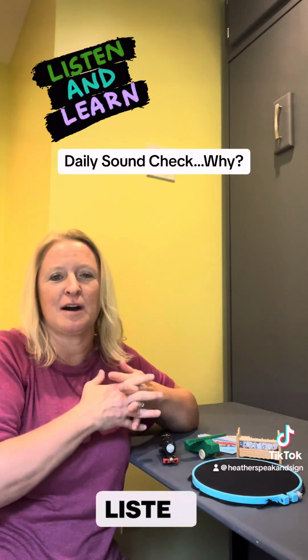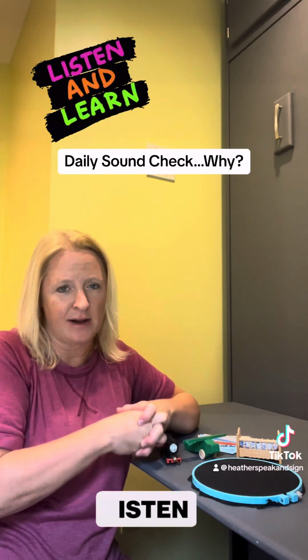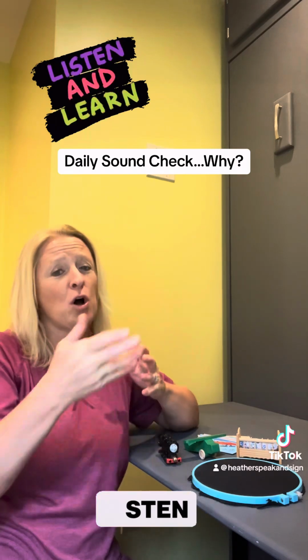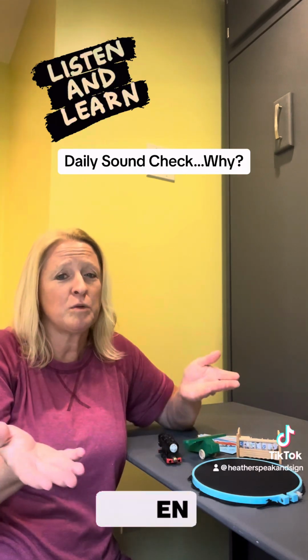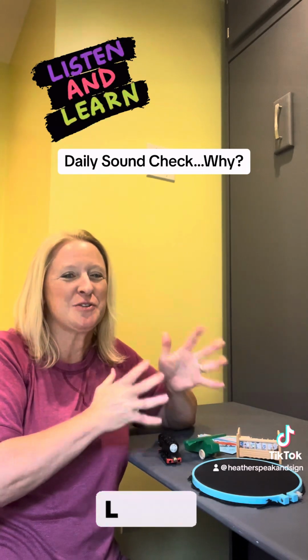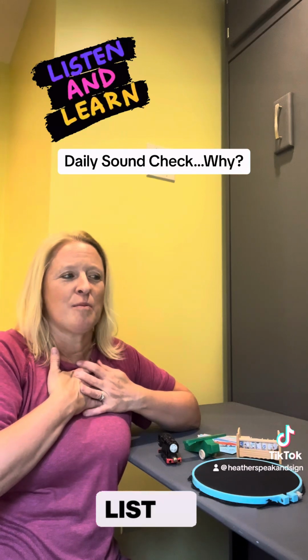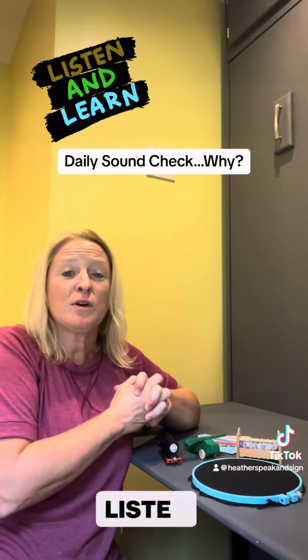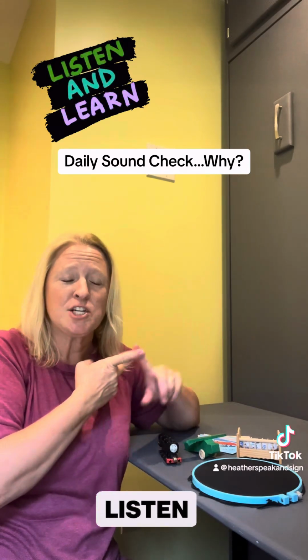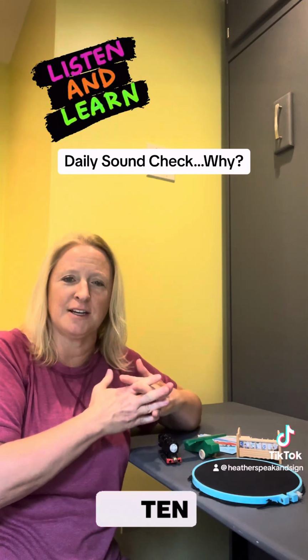But that's our job. We need to make sure that when they are at school, they have the best access possible. Does it always have to be the SLP? No. I have the luxury of working with teachers of the deaf who can do this. I still do it when they come to my room for therapy. But if you don't have a teacher of the deaf, you can also train paraprofessionals, classroom teachers, and make it part of that daily routine.